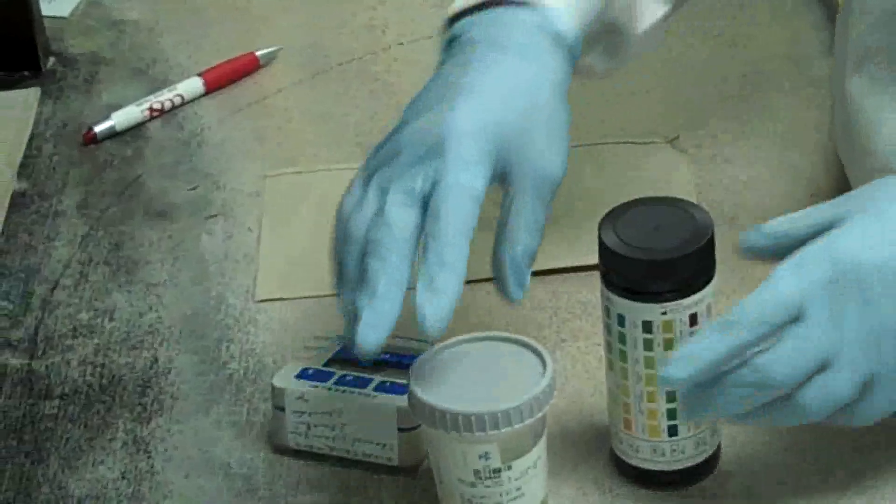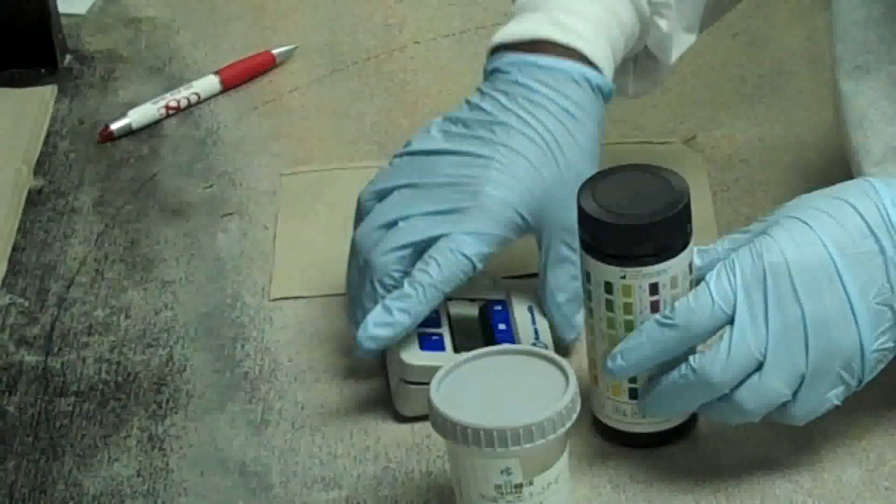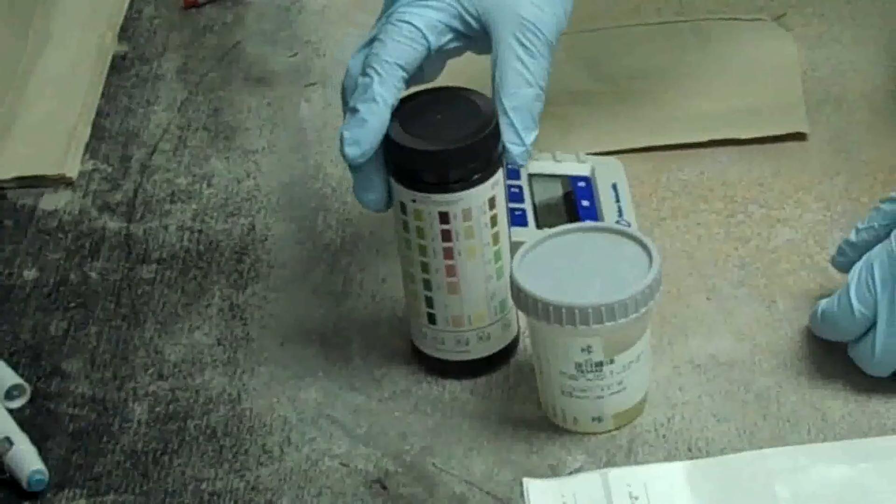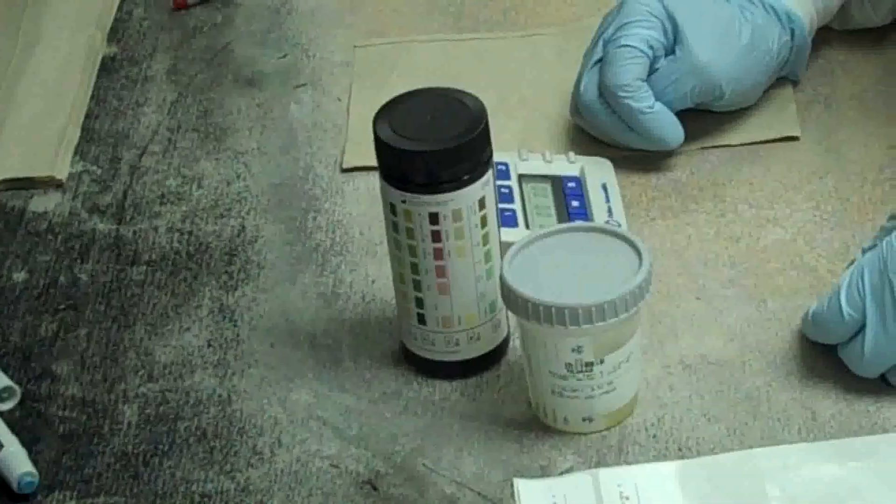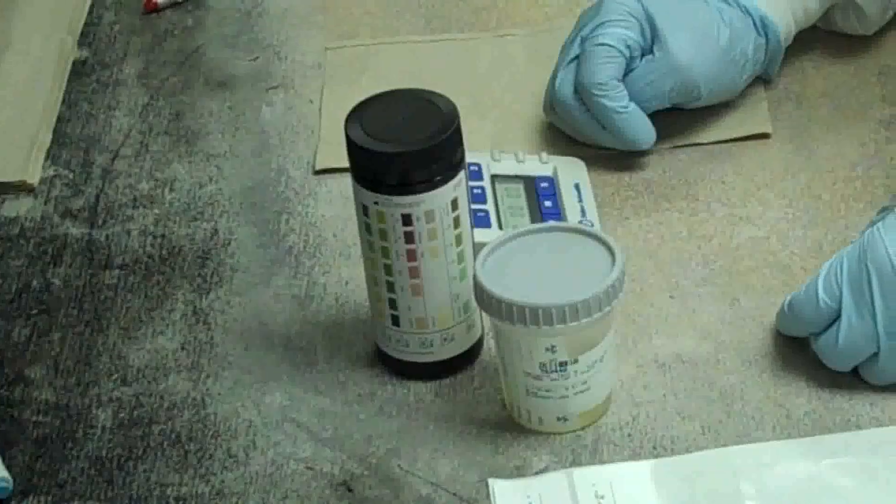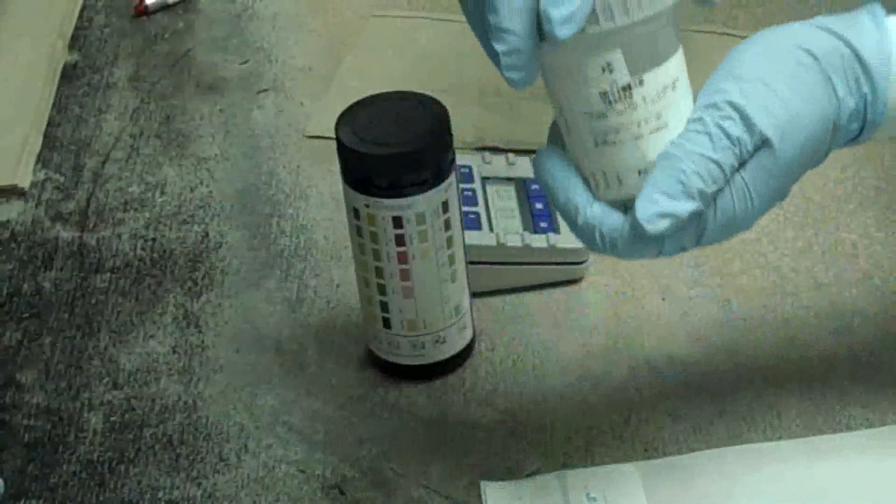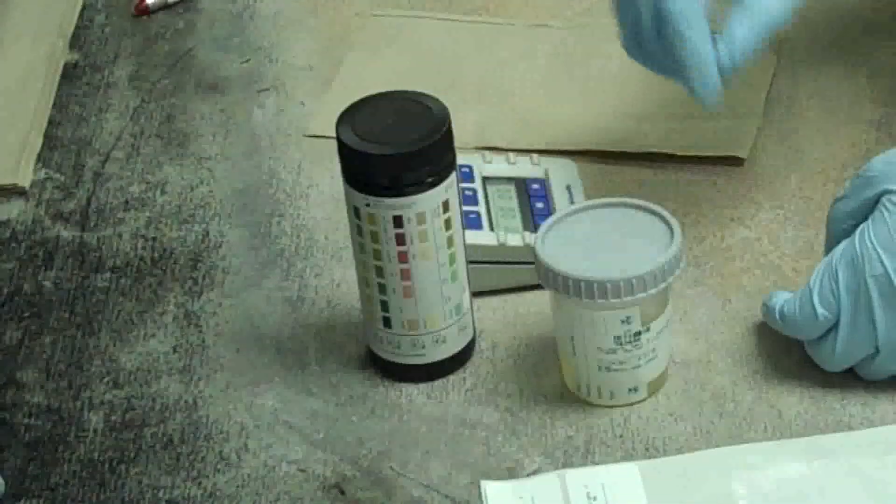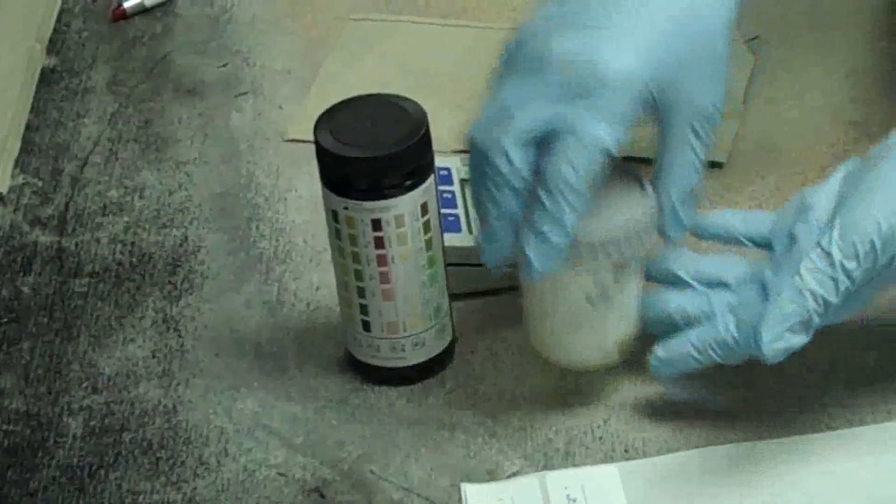Obtain a fresh urine specimen. Specimen should be at room temperature for less than two hours before testing. Collect the urine in a clean, dry, covered container. The urine specimen should be well mixed and uncentrifuged.